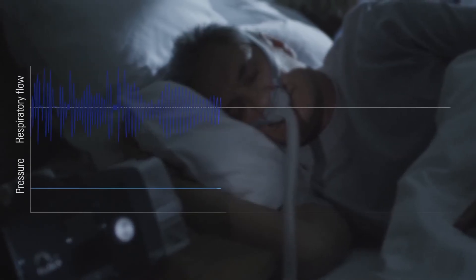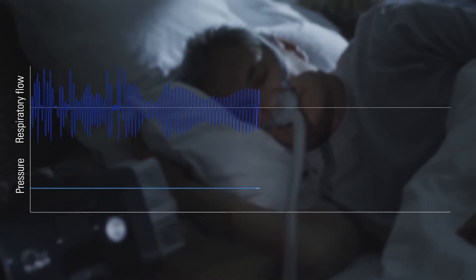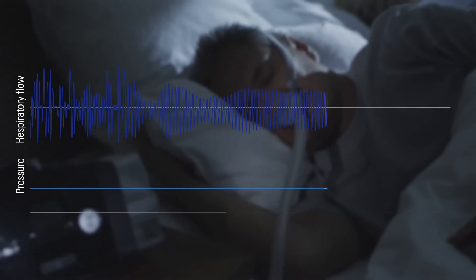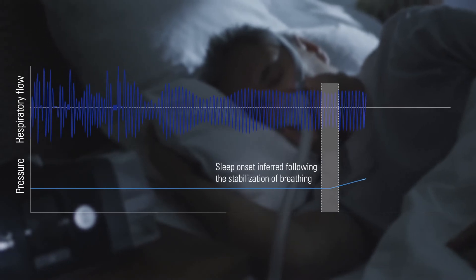ResMed's AutoRamp feature with sleep onset detection helps make therapy comfortable from the moment you press Start. It works by delivering a low pressure to help you fall asleep with ease, then comfortably increases the pressure to your prescribed level the moment you fall asleep.